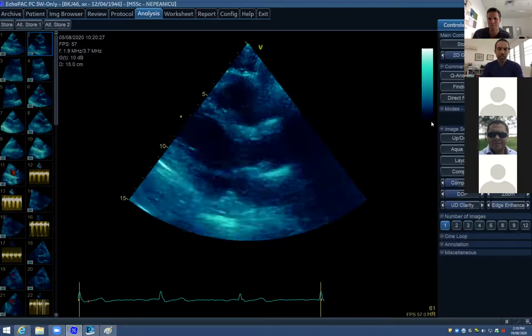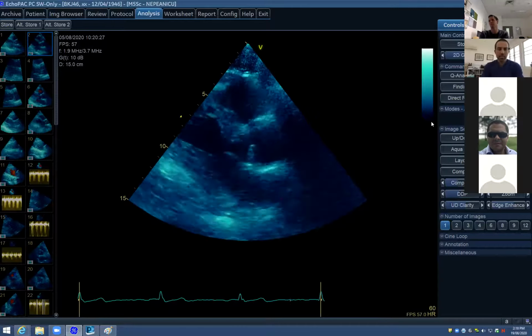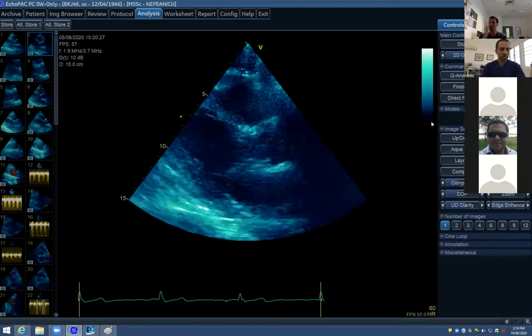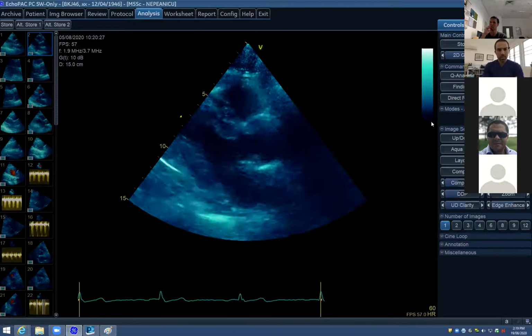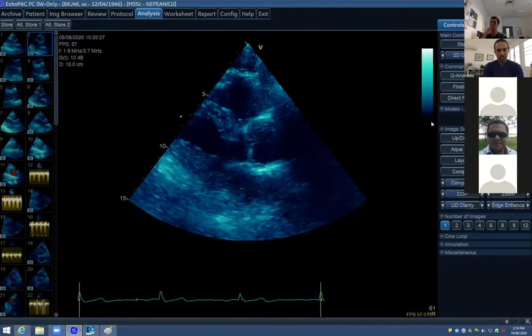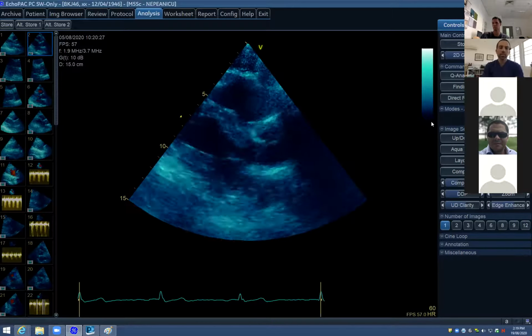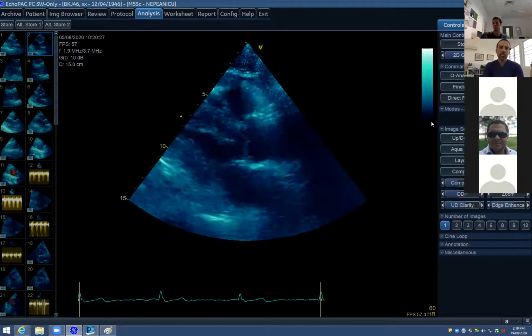Sure, I'll try. So parasternal long axis, the left ventricular size appears normal. The walls, without measuring them, appear hypertrophied, both the posterior wall and the anteroseptum, with a sigmoid-shaped septum. The systolic function looks okay. I'd like to interrogate his diastology. The left atrial size doesn't look too enlarged. The mitral valve, as far as we can see in 2D, looks normal, as does the aortic valve. Perhaps the aortic root looks a little dilated, or the aortic sinuses, but we need to measure that.